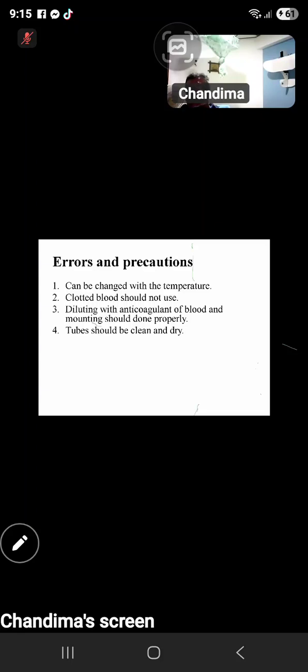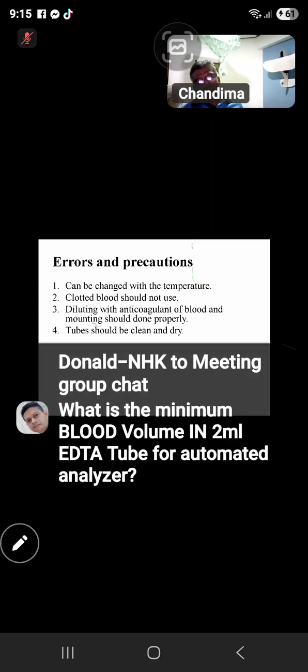Is the 45-degree angle method recommended? Yes, it is recommended by the WHO. If you go through the Dacie and Lewis Practical Haematology book, they clearly say it is a recommended one. But normal ranges have to be developed in your own laboratory. They say in that book that laboratories have to develop their own normal ranges.